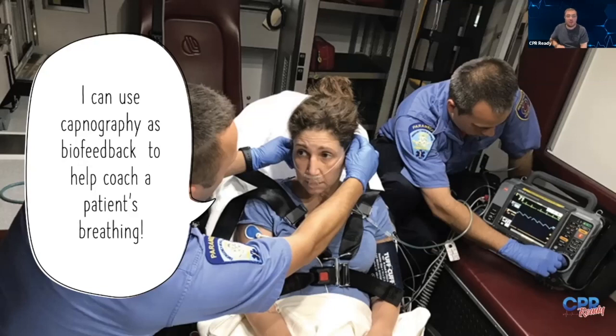So how can you use capnography for this? It's not going to diagnose whether it's necessarily a panic attack versus something else. But if you really do your good assessment and you have a reasonable belief that, hey, this person has low risk factors, they have good health, all of my other assessments are coming back, and this really seems like they are having a true anxiety attack, a panic attack, they're hyperventilating, right? Capnography can be used as biofeedback. This is a really cool use of that because we've all been there, right?